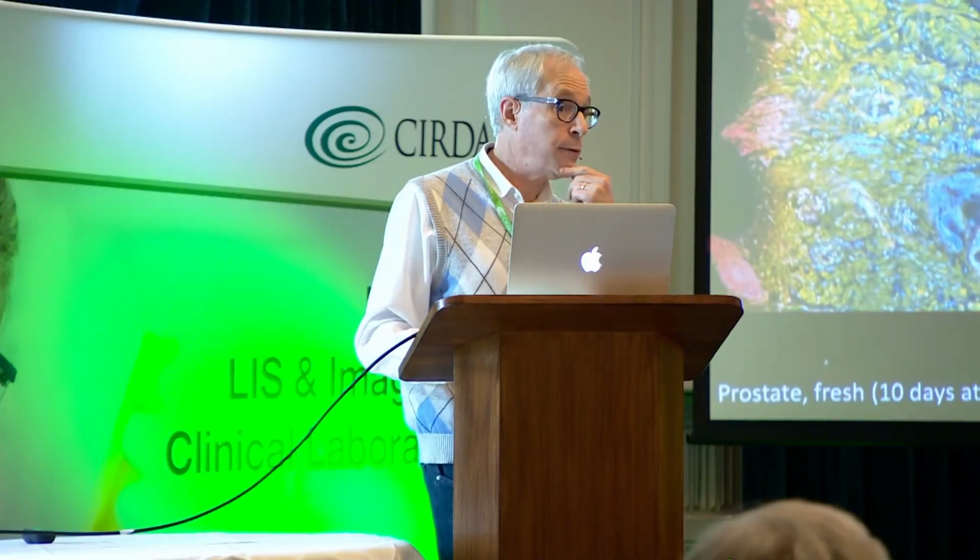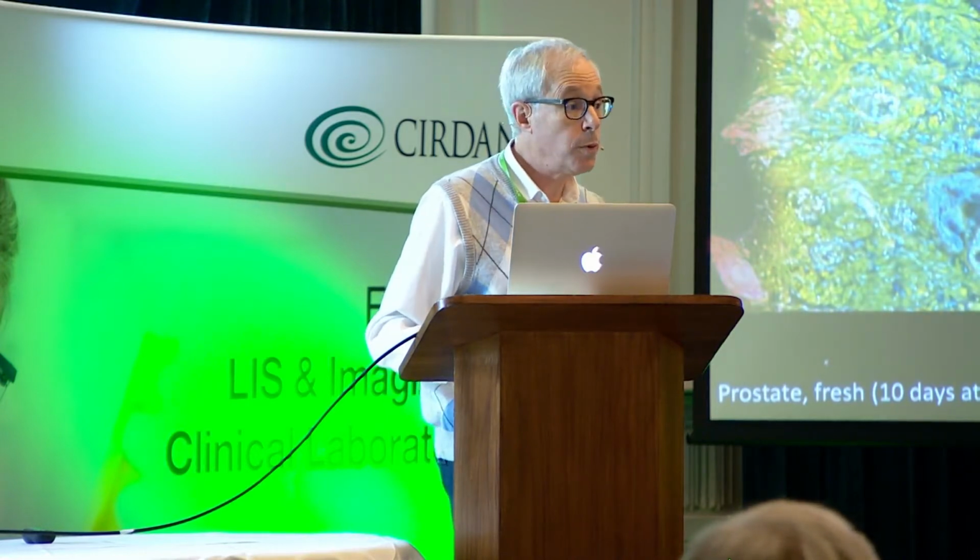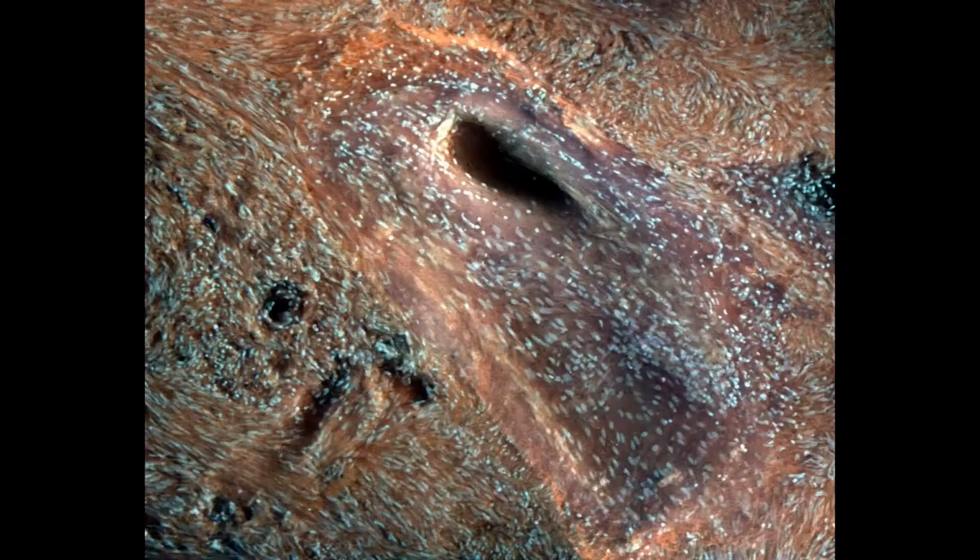What's fun, and we haven't done enough of it, is that we see some wonderful stuff with smooth muscle or connective tissue tumors. So here is something, I can't remember now what this is, but I think it's a GIST, gastrointestinal stromal tumor. And although we haven't pursued it, I think we're looking at some of the pseudovasculature that's found in GIST tumors that convey blood but aren't formed with endothelial cells. And so you can get a very nice appreciation of how these things organize themselves.